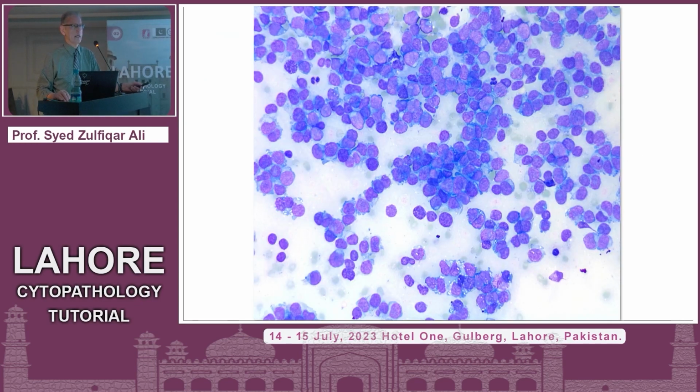So that's the FNA. You can look at the cellularity, the amount of cells, the appearance of the cells, the N/C ratios, the background, whether cells look lymphoid or otherwise. So this should be enough to make the diagnosis. You agree? Or more? But do you think the flow idea was a good one? I'm so happy you agree with me.